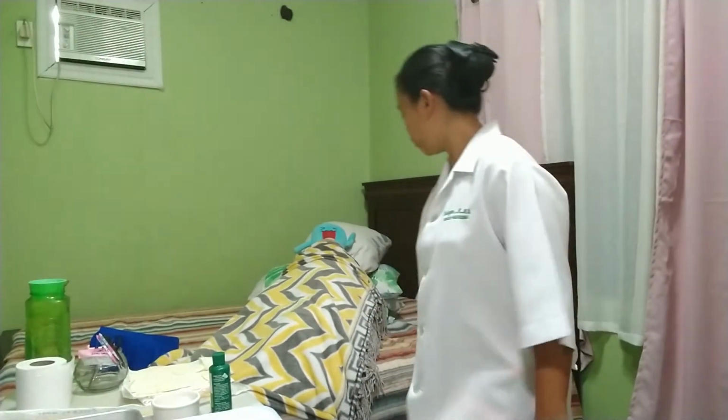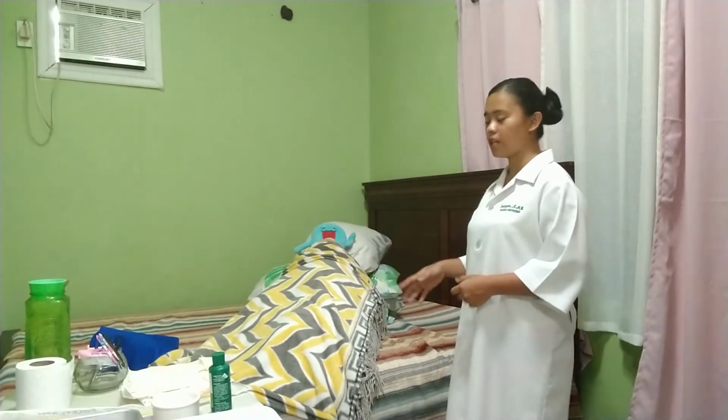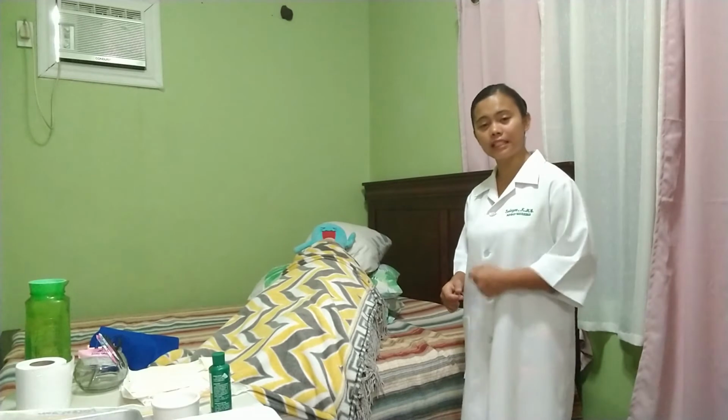That's by drawing the curtains around the room or closing the door to the room. That is also an effective way of making the patient feel safe, secure, and not anxious or less anxious. The next step to follow is to place the patient in a supine position. This position will allow us to better see the meatus of our patient and to allow us for easy access.